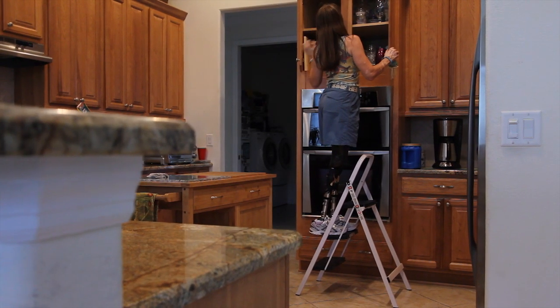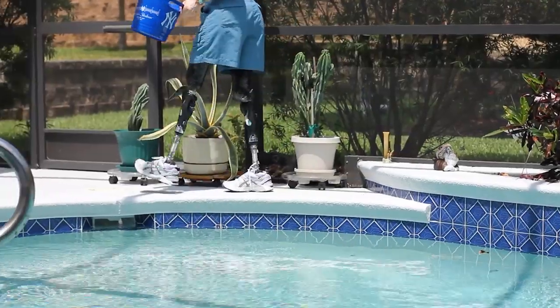As far as safety, they have saved me several times where I probably would have cracked my head open. They're definitely safe for bilaterals.